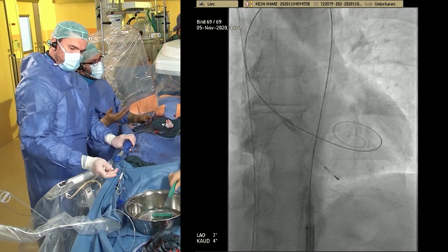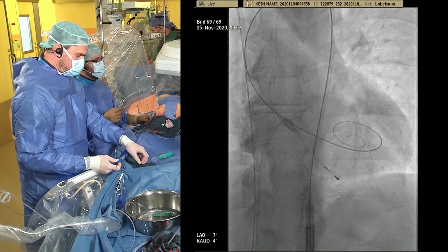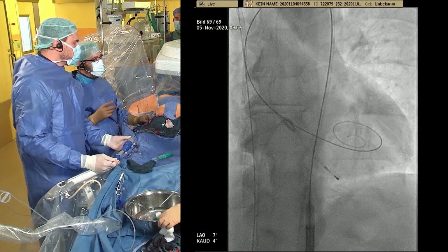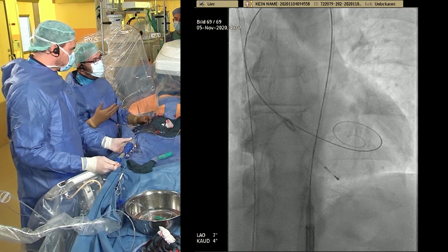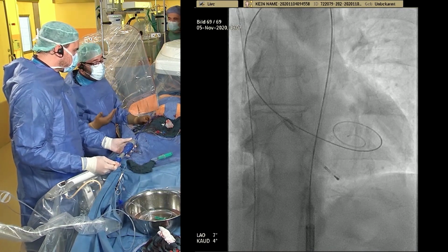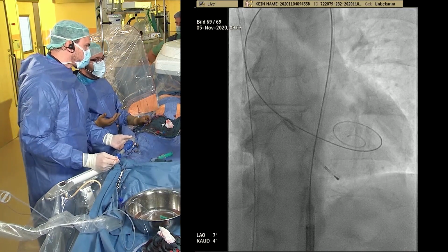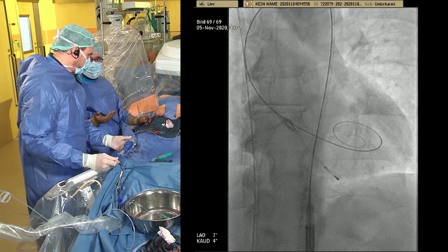Small anatomy could be something that can favor TAVI, but there are also a lot of surgical options. We can discuss this, of course, as well. The short membranous septum could be, in my opinion, an argument for surgery, because I'm not sure whether we have total control in the case of a very short septum, as in her case. So we will do our best, but at the end of the day, we also need to anchor the device, so we'll not be able, and we're not aiming at implanting the device at 0. Yes. I think not even at 1, so we'll try to implant maybe at 2 or 3 millimeters. It's very important to consider implantation depth, but also in the context of the small anatomy, coronary axis, and anchoring.